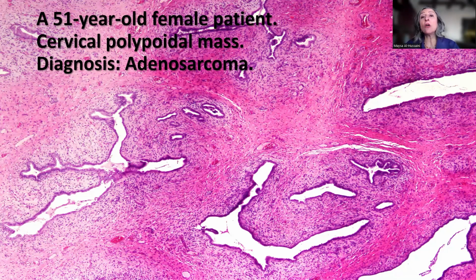A variety of epithelial metaplasia can be encountered. This should not sway the pathologist away from rendering the appropriate diagnosis for the case. The treatment usually is hysterectomy, and then the stage depends on the extent of invasion of the tumor into the uterine wall. I hope you find this tip useful in your daily practice.